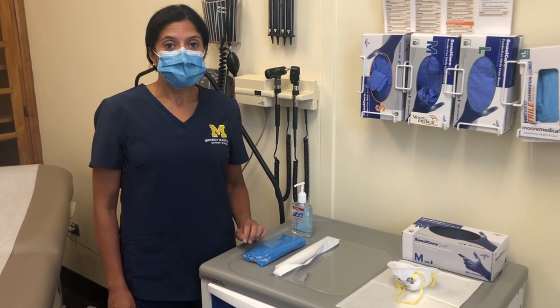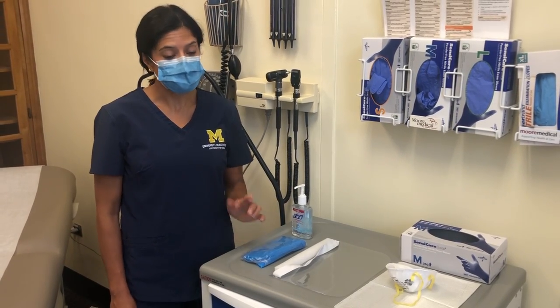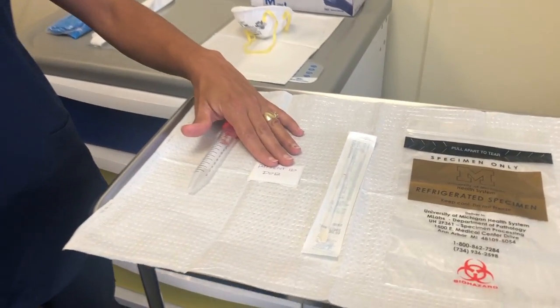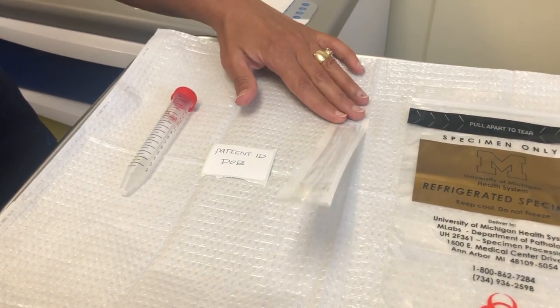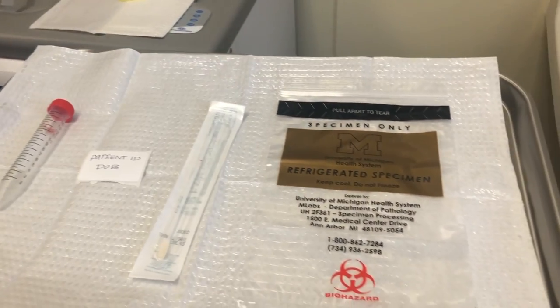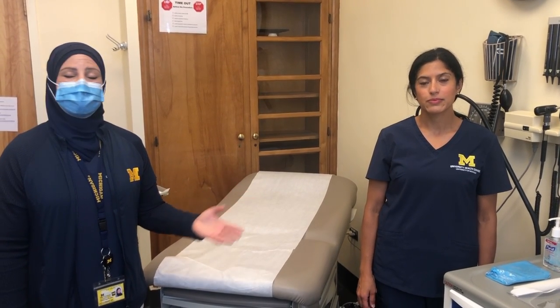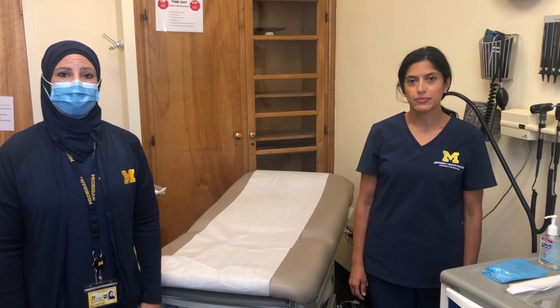Then you'll want to gather your supplies for actually collecting your swab, which we have here. So you'll have a viral media tube, a patient identifier label, a swab, and a specimen bag. Now I'm going to play the role of the patient and Heather is going to play the role of the provider. Heather is now going to show you how to properly put on your PPE.